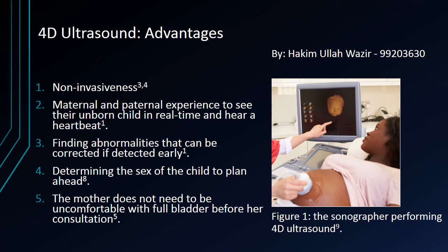Number 5. The mother does not need to be uncomfortable with a full bladder before her consultation, although you may be asked to drink plenty of water 2 days prior to the scan as this has been shown to result in better images, but you are not required to have a full bladder during the 4D scan.